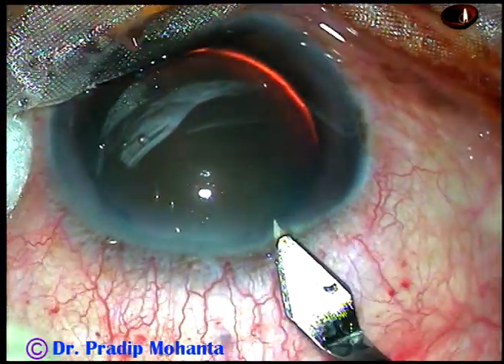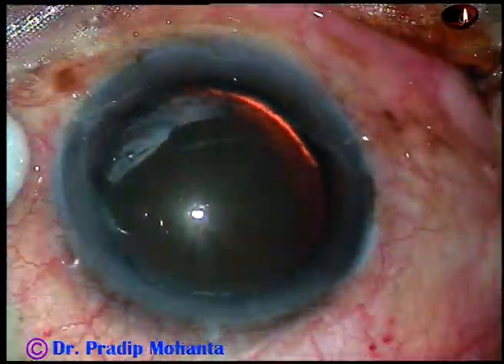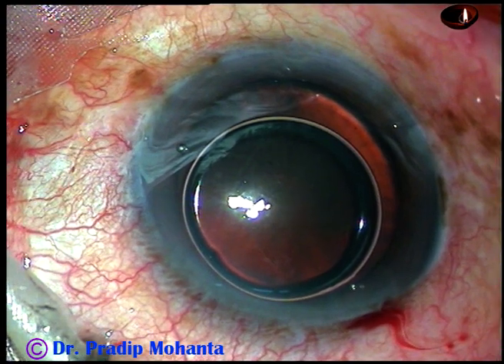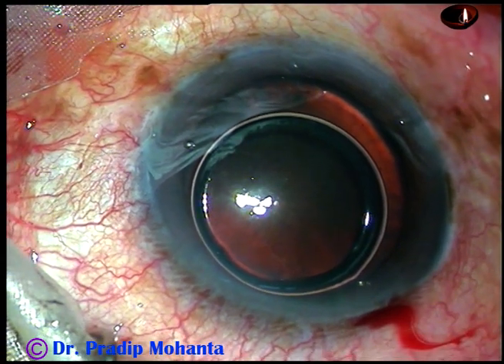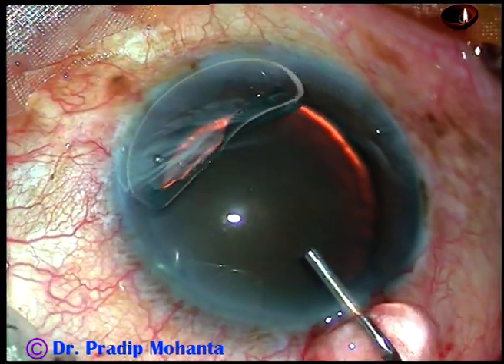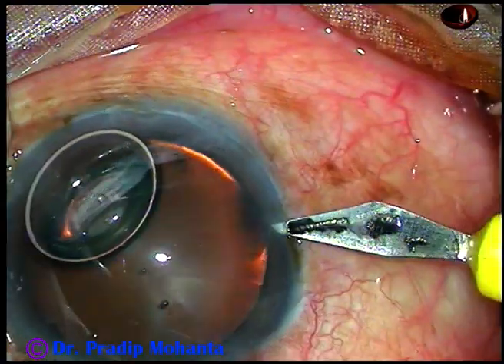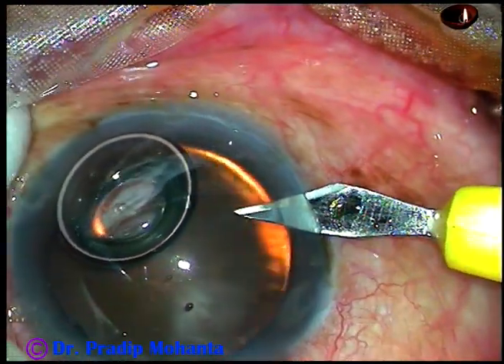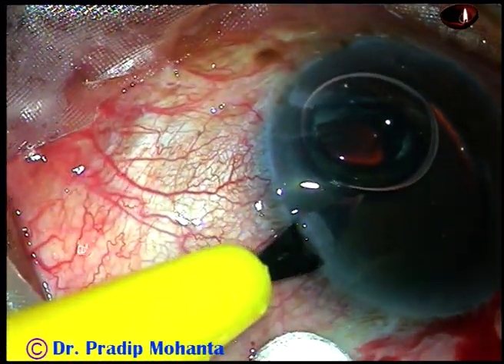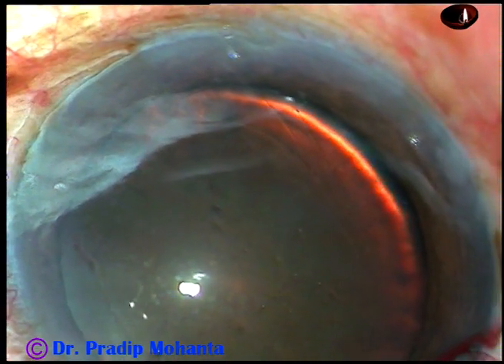This is the main incision on the posterior aspect of the limbus with a 2.8 mm keratome. I injected an air bubble and considered staining the anterior capsule with trypan blue dye, but did not stain the capsule in this case. Here goes Visco, 2% HPMC. I made two side ports — one on the right side and one on the left side — and injected some more Visco to replace the air.